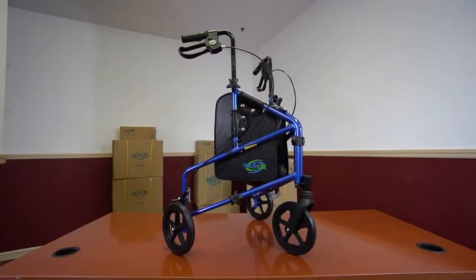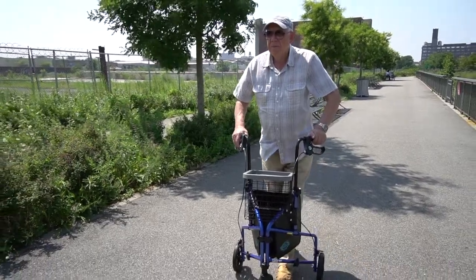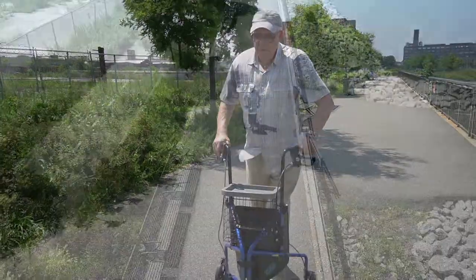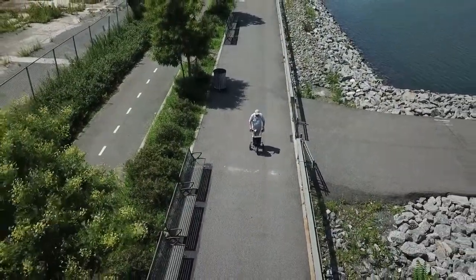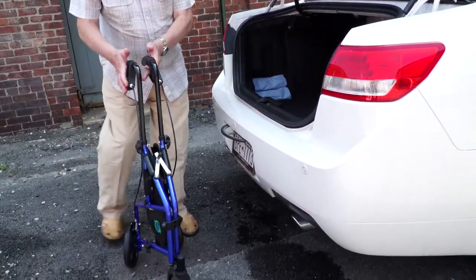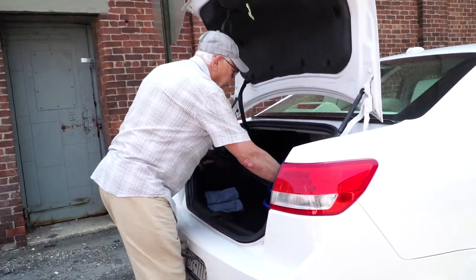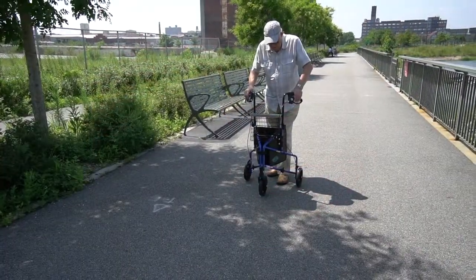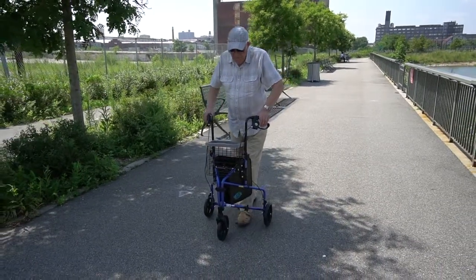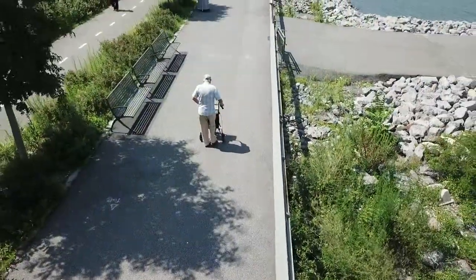Your three-wheel Rollator is fully assembled and ready to go. Now you can enjoy long, satisfying walks around your neighborhood. You can also take your Rollator with you anywhere by folding it up in mere seconds and safely storing it in the trunk of your car. Easy to assemble, sturdy and reliable, the three-wheel Rollator with handle brakes and a pouch from Healthline USA will help you get wherever you want and enjoy the fully active lifestyle you truly deserve.